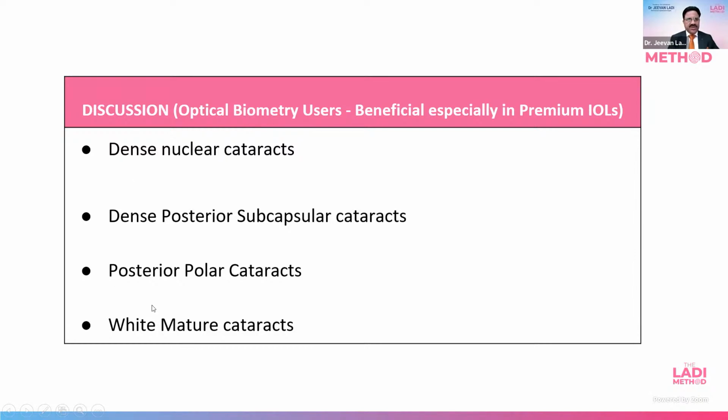In the Western literature, according to Rhonda Wharton, the incidence of these patients is 22%. But as you go towards developing countries, or rural, urban, semi-urban parts, the incidence of dense cataracts and people reporting late is quite high. People today are demanding premium IOLs, multifocal IOLs, to get rid of glasses and remain independent from glasses, which is beneficial from all points of view.